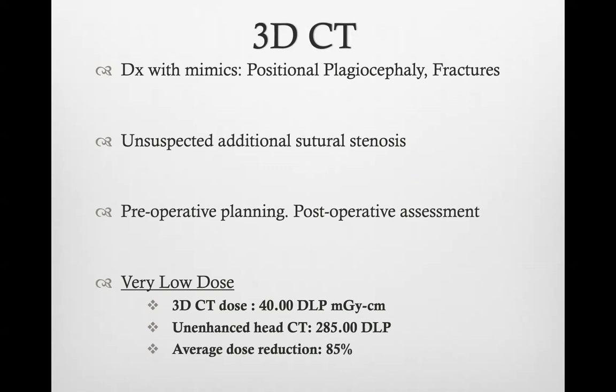Very, very important. But remember, this is very low dose, and these new techniques allow us to reduce the average dose by 85%. So really, the difference with radiograph is minimal to none in terms of radiation burden, but the change in the diagnostic yield is dramatic.